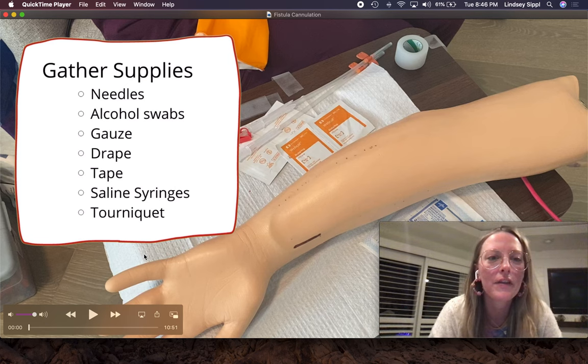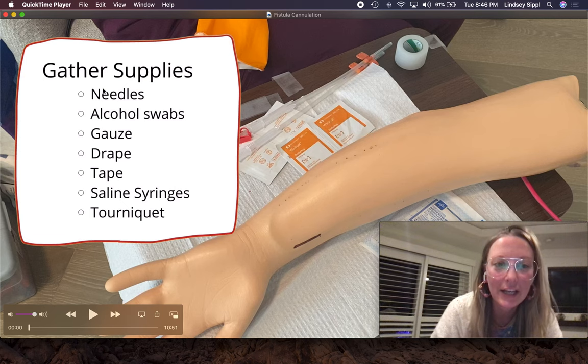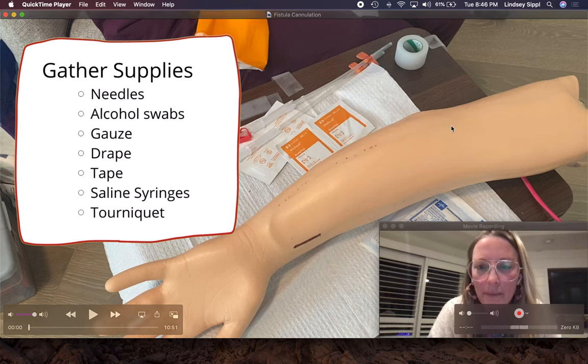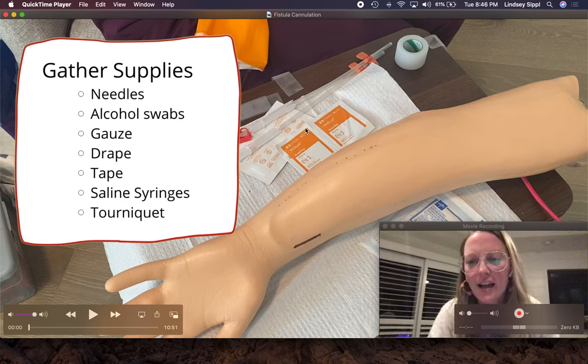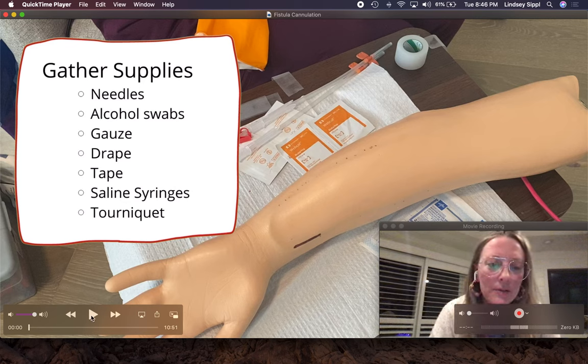These are all the things that I need to cannulate a patient. The drape is this white pad that is under the patient's arm. It has a plastic underside and will catch any blood that escapes the fistula and help protect the patient's clothing and all of our pillows and blankets.